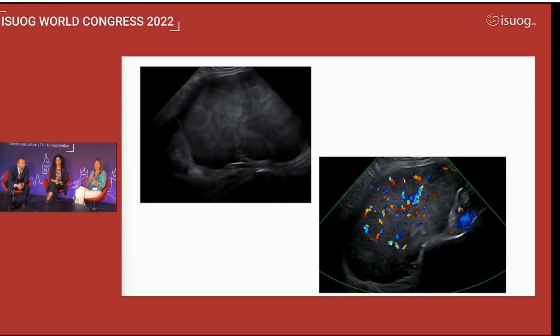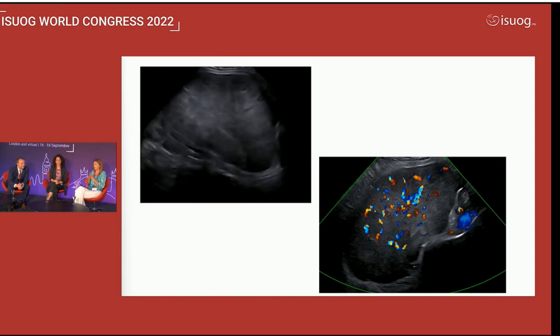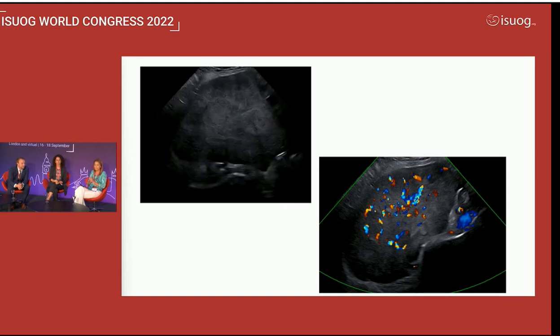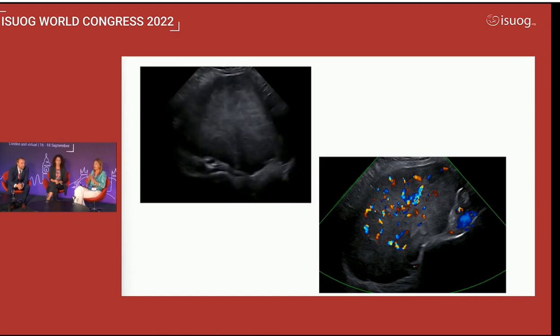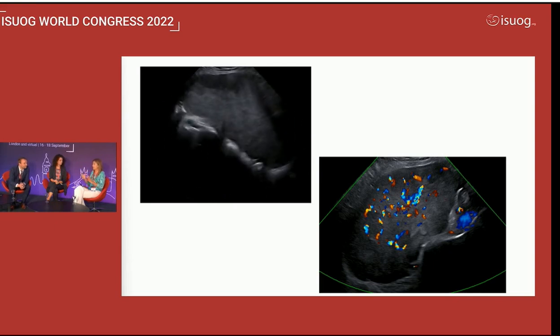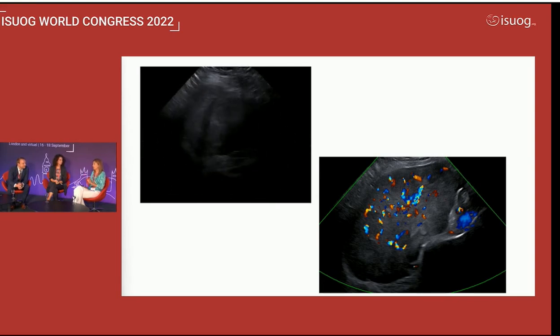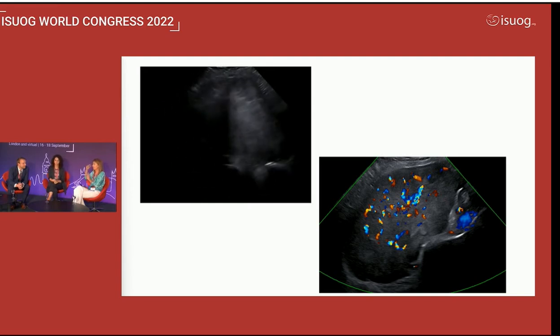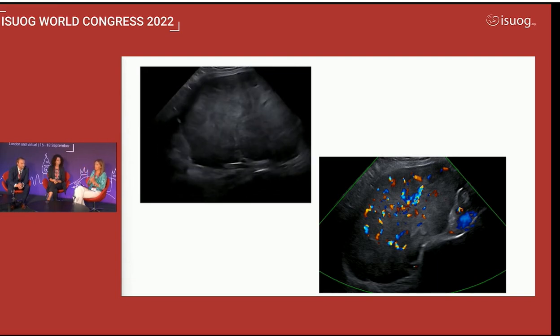The structure is different. You have to admit that it's not like an ovarian fibroma in any case. So vascularization, I would say moderate, color score 3. At least, yeah, I agree. Always in young ladies, dysgerminomas come to my mind, something among germ cells, immediately. Instead, for ovarian fibroma, also the age. Usually the ladies are 40, perimenopausal, etc. Young lady, I think of that.